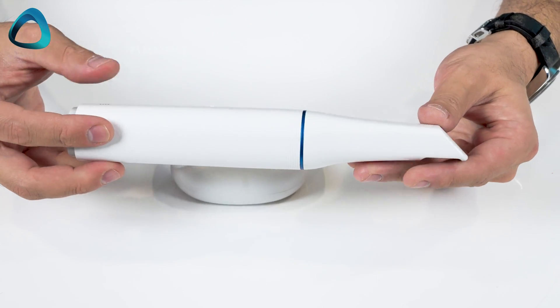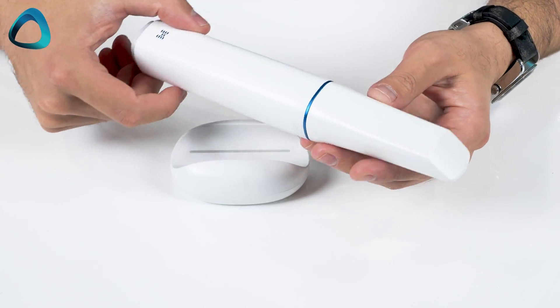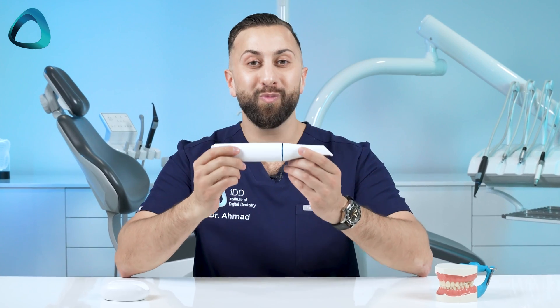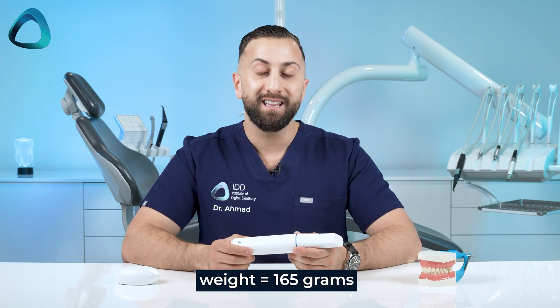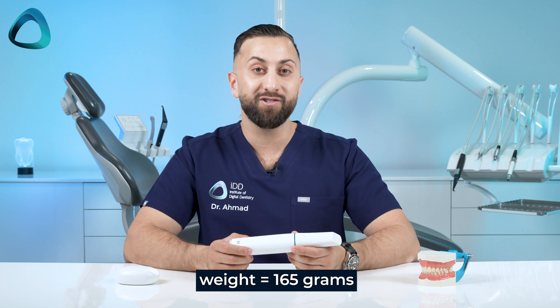So let's go over a few notable hardware features of this new intraoral scanner. For starters, it's tiny. Look how small the i900 is — it's one of the smallest and most lightweight scanners on the market right now. At only 165 grams, this makes it almost 100 grams lighter than the i700 and less than half the weight of many other intraoral scanners.